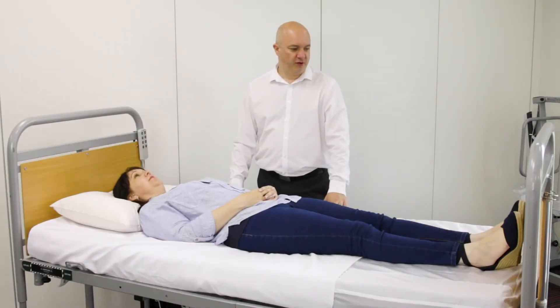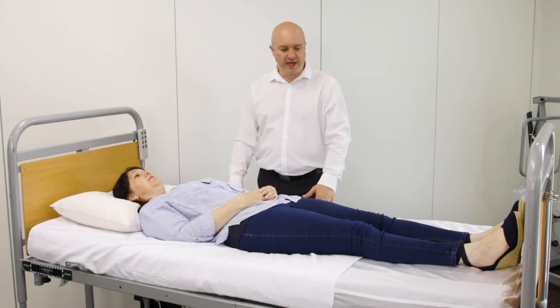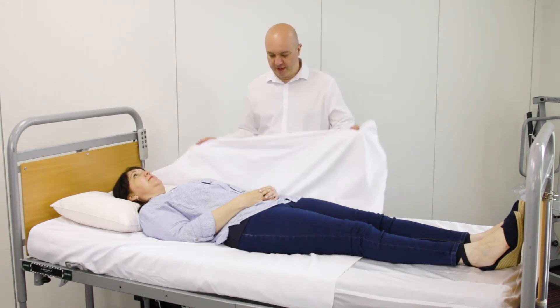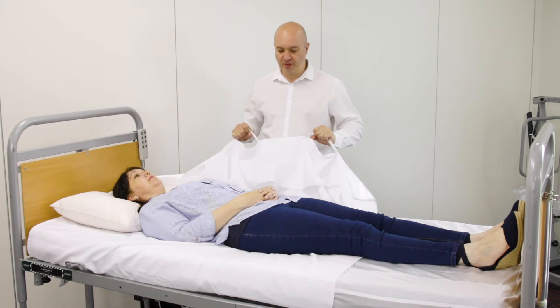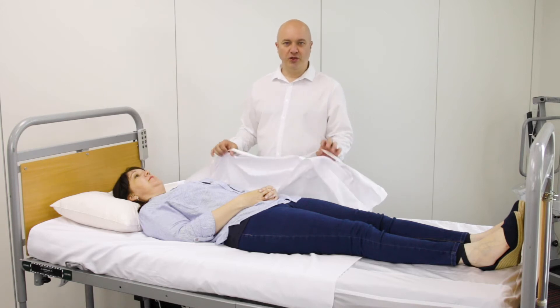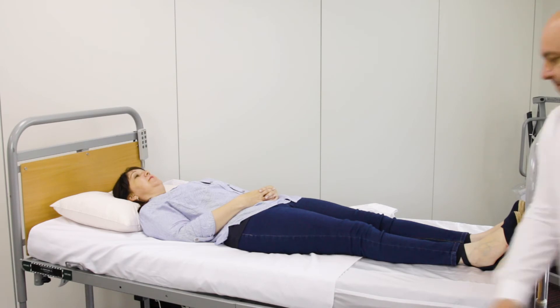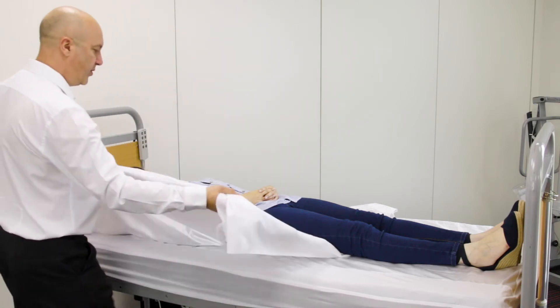Now that we've got Sarah on the bed, I'm just going to move her around a little bit — backwards, forwards, and up and down the bed just to show you how the system works. The first thing we need to do is untuck the sheet. It's tucked in when a person is lying on the bed if you want to leave them to sleep. Now on this top sheet it automatically comes with handles. Handles can be used for holding, moving, and sliding. A lot of care staff don't like handles as they're not used to having them, so they would tend to prefer to just hold the sheet itself — either is fine, whatever your preference is. Come round the other side and untuck this side as well. Once it's tucked in, it kind of activates a little lock system on the side and stops the person moving around and sliding.